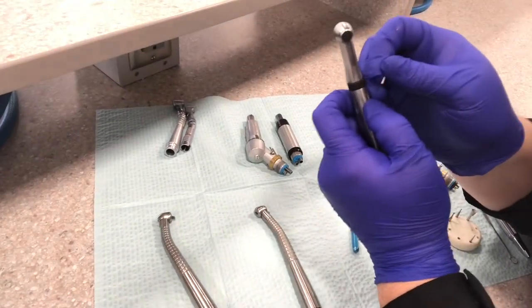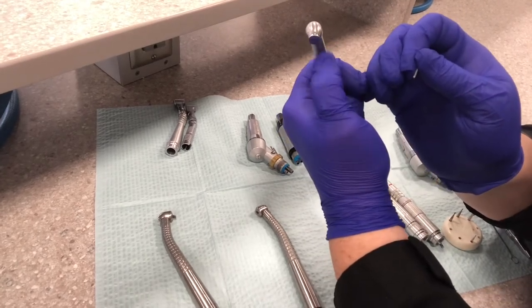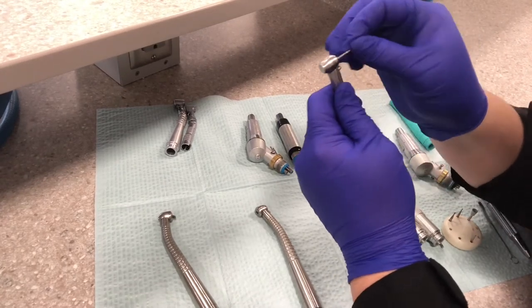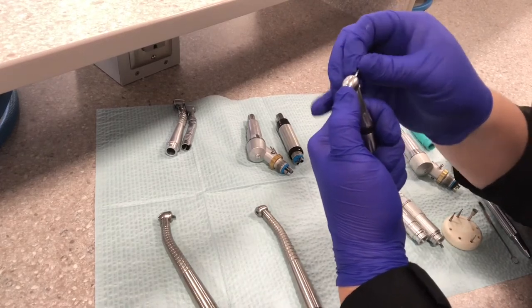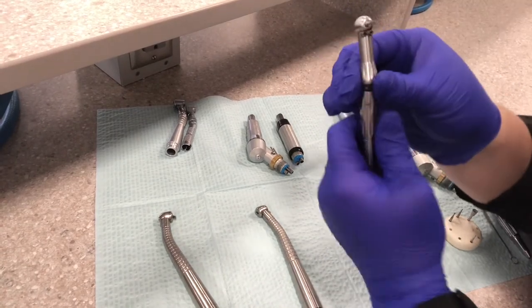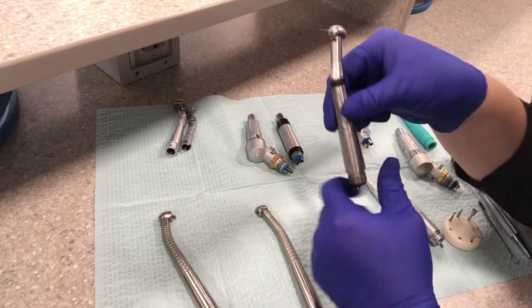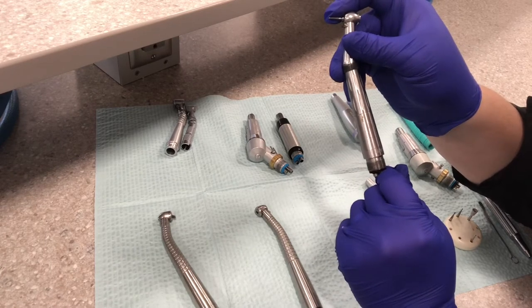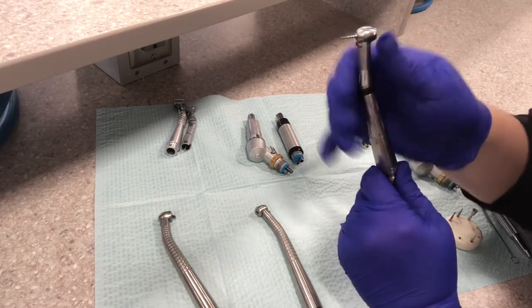This one here is a push button. The back of the head you actually just push with your thumb, and you still place the burr in the front. Slide that down — you have to push on this to push the burr down into place. Then let go and give it a pull to make sure it's locked in there. The fiber optic light and the water spray out the front. So again, this is all one unit. The high speeds don't have attachments; they have a motor and a turbine all internally.